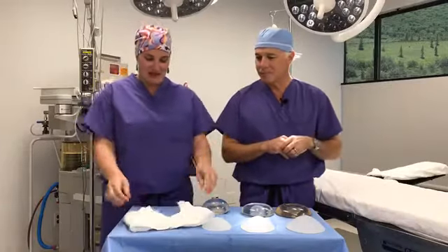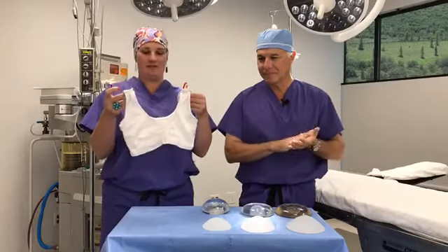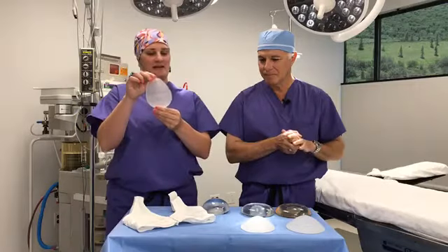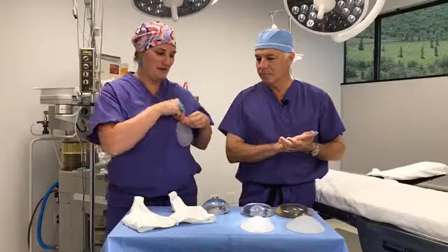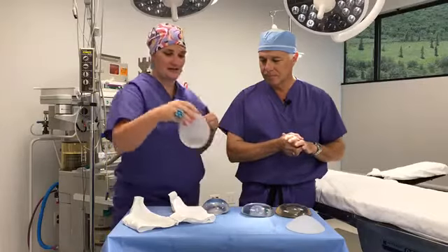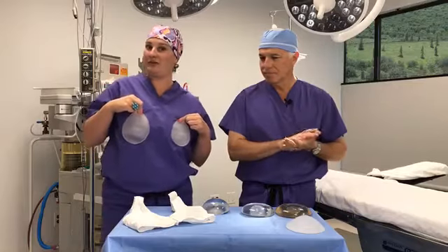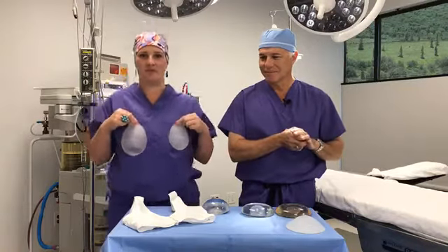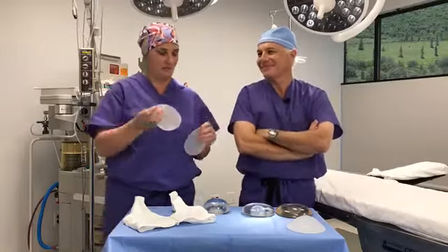So you put this tight, kind of uncomfortable white bra on, and what we do is we start slipping the implant sizers into the bra and mimic the size that you would like to be. I've had patients who are marathon runners who want to put the bra on with the sizers in, and jump and run around the office to see what they will feel like, which is totally appropriate.